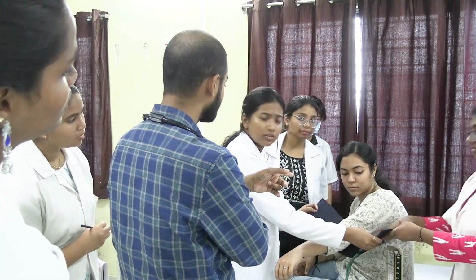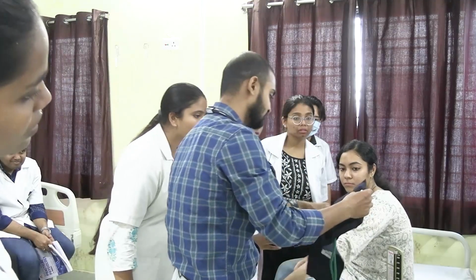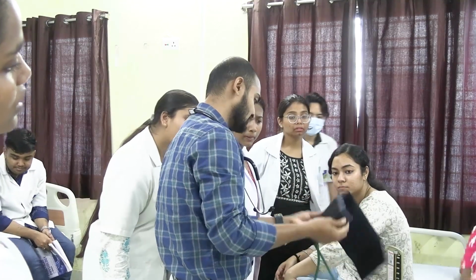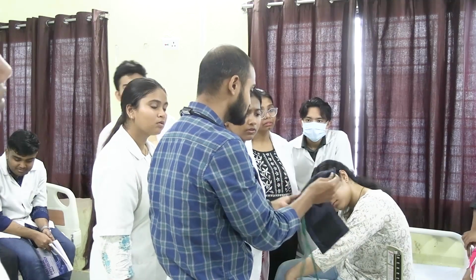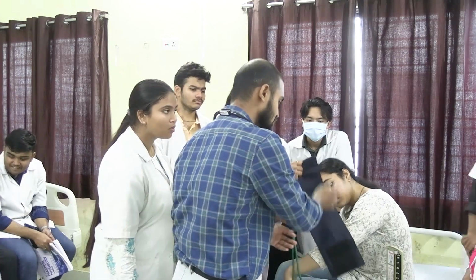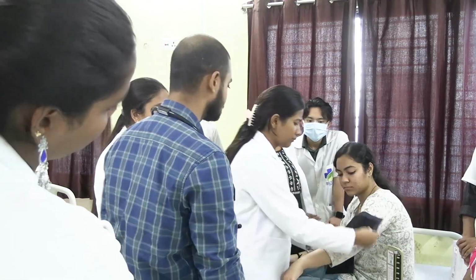Okay, where is the rubber bag? So this. See the rubber bag, you can feel it, no? It starts from here. There is a stitch. See, it starts from here and ends here, no? So this part should be covering 2/3 of the arm. So not this one. First cover the arm with this part.